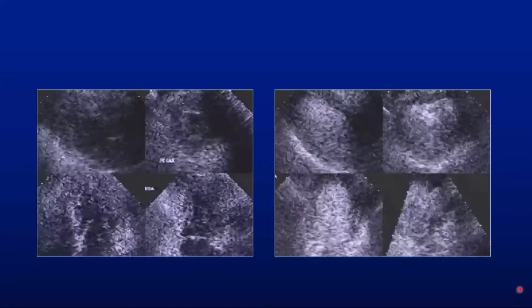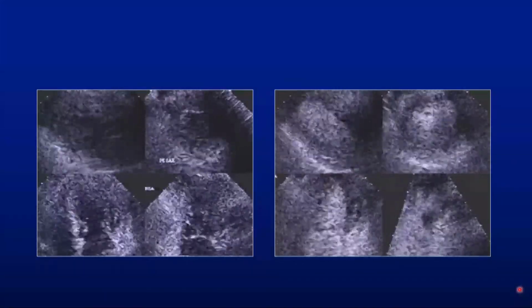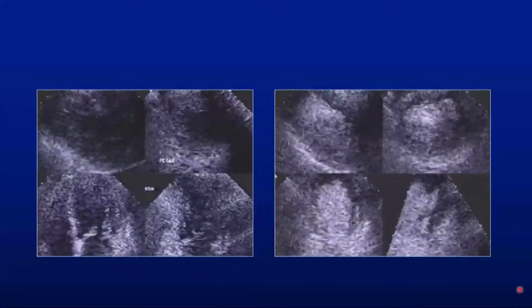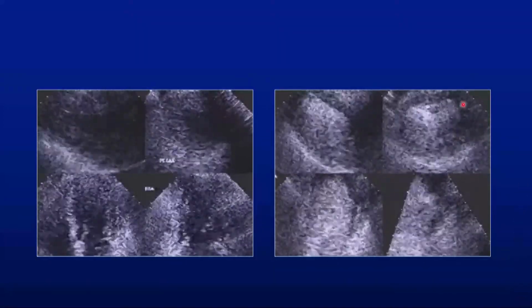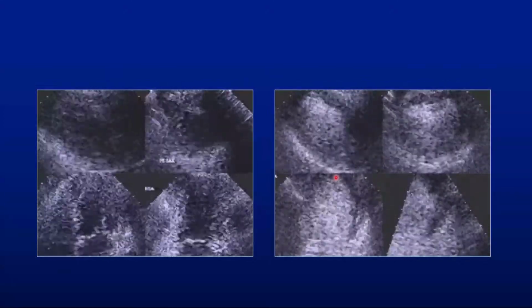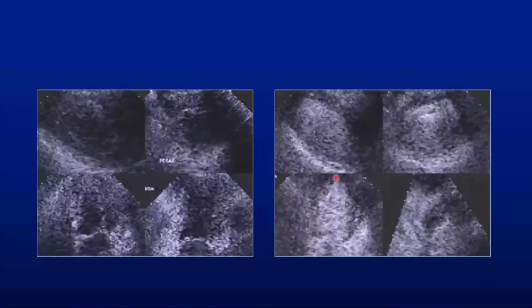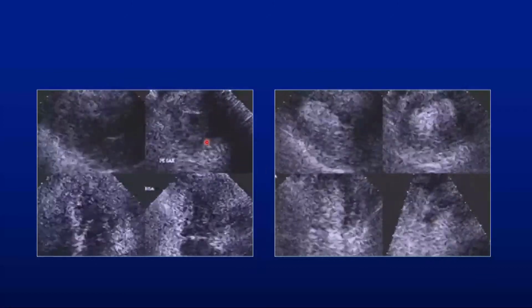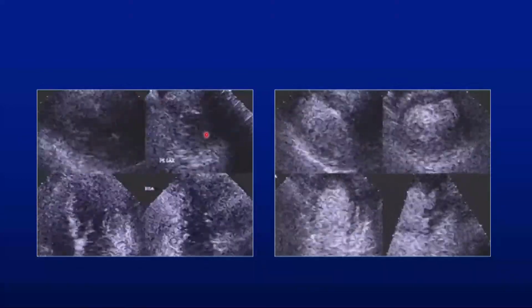And here it is. A very unusual location of a wall motion abnormality that you could see on short axis is in the anterolateral wall, and distally, the heart is good. So what my eye did is link from 2 o'clock to about 4 o'clock.